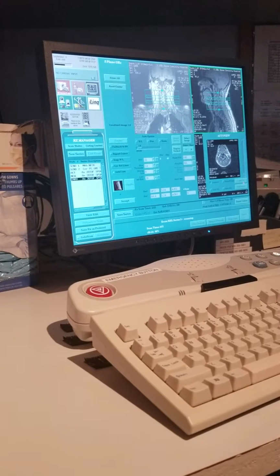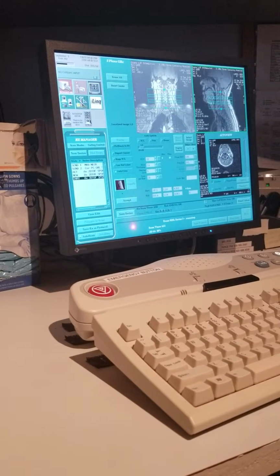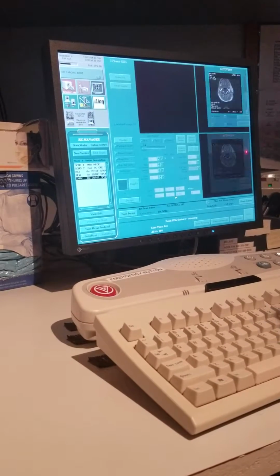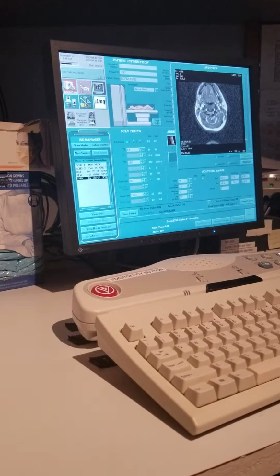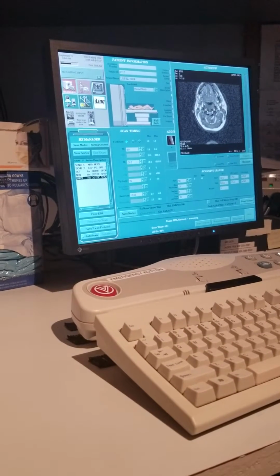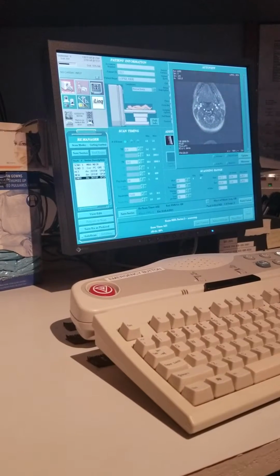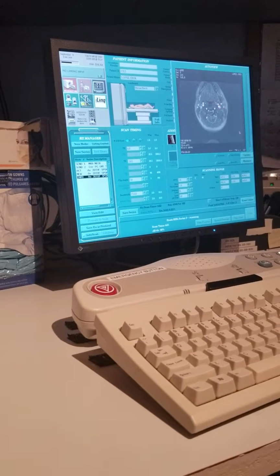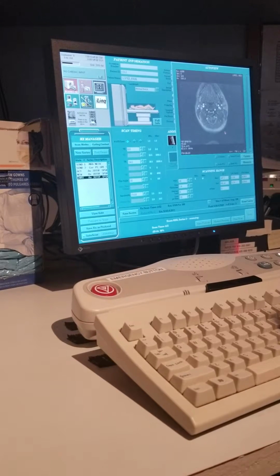So we can't really see too well here, it's kind of small. So why don't we go ahead and hit accept, even though we're not done. You can just hit accept. And then we'll maximize this. And then we're going to take the brightness out of the scan. Good. See how we see it separate? Yeah, separated right here. See that? And the vertebrals.